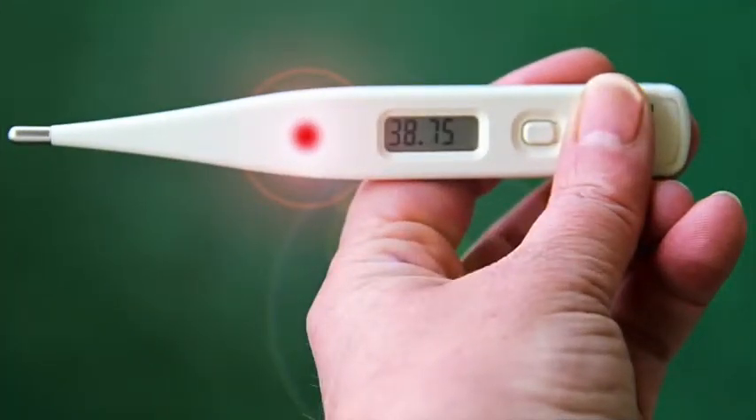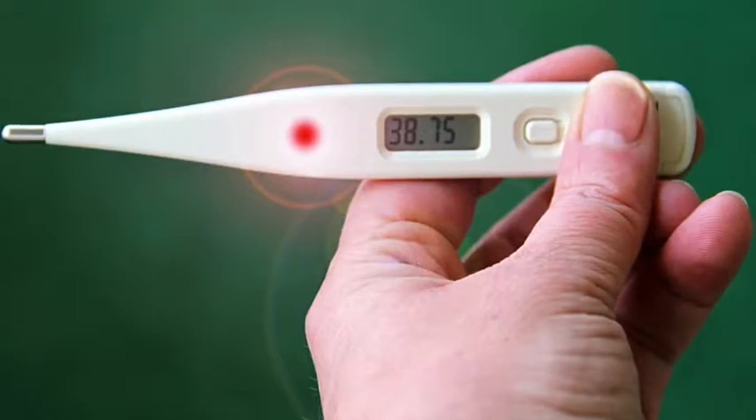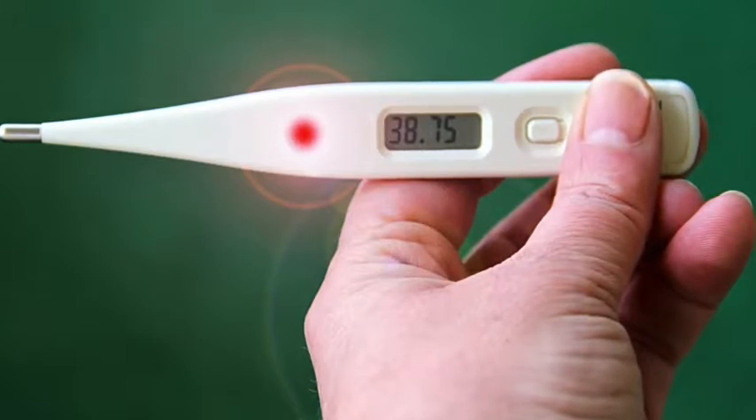Let's not count out the pros of a digital thermometer, which is that they are easier to handle. Their fat little ends are really simple to hold on to. You don't have to remember to shake it down the night before, which is great, and it won't shatter on your bathroom floor if you drop it.